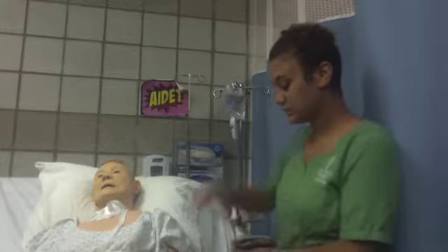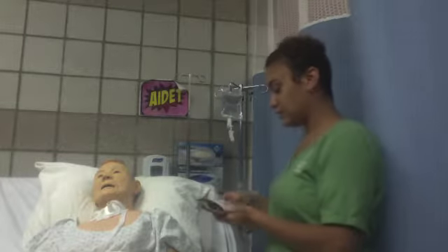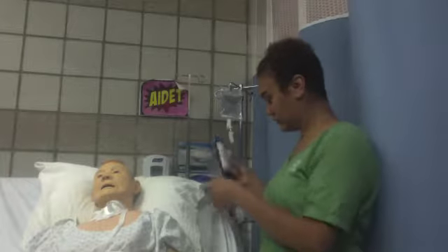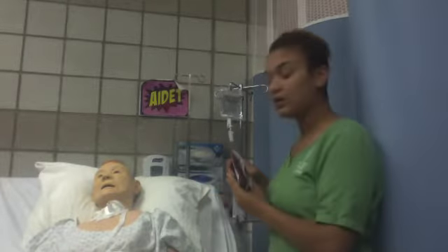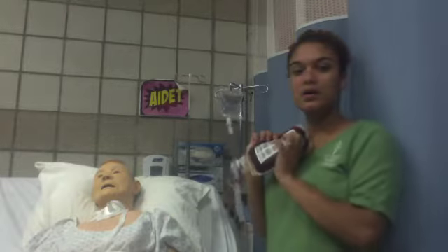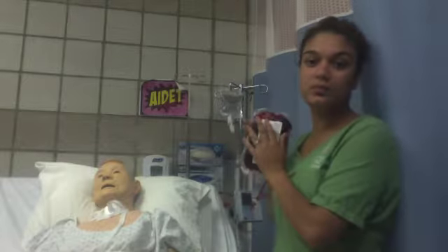We've scanned the bracelet, the bag, the saline, the sites, anything we need to scan. Any medications that needed to be scanned were already scanned and verified and scanned into the computer that we are using. So we're going to go ahead and, alright, so we've done all that. Alright, so we both verified all this with the blood. Any numbers that need to be peeled off the back have been put on the proper placements.